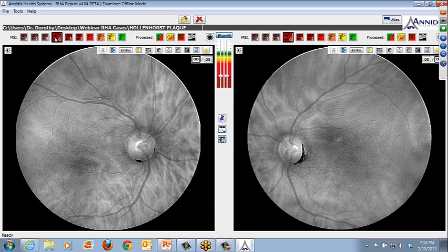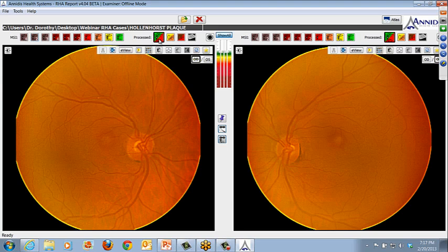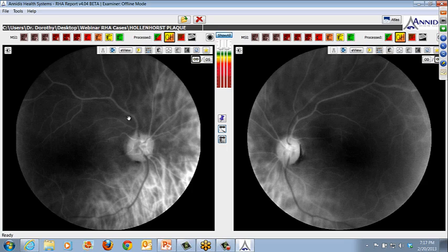It's hyper-reflective. It's a highly condensed cholesterol plaque, and so it will persist through the other images and finally start to fade here. In this case, you can also see that this is non-occlusive, okay? So this is a non-occlusive atheroma, if you will, which is what Hollenhorst plaques are, right? In some cases, you can get a larger Hollenhorst plaque that's in the posterior, just anterior to the lamina cribrosa, and it could momentarily block blood flow or in fact block blood flow, but typically these are non-occlusive, and it's validated on the oxy map because there's certainly blood flow past the plaque.